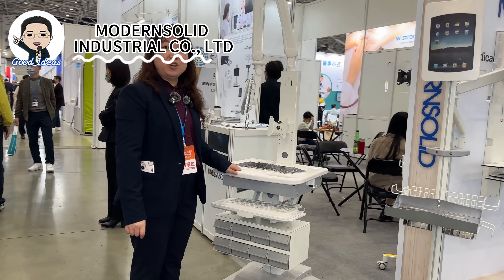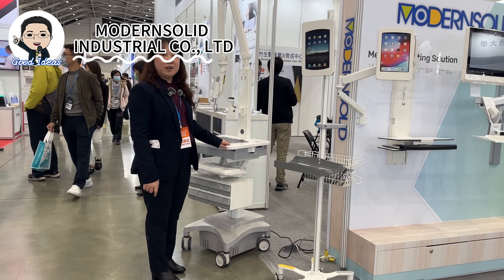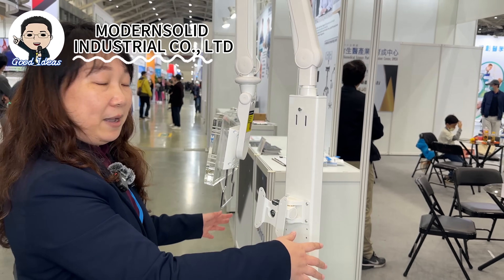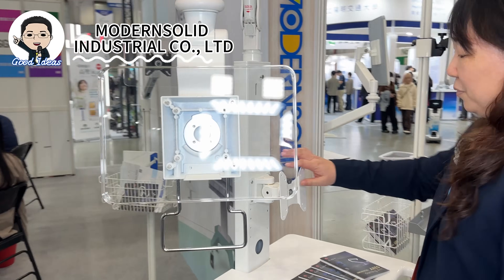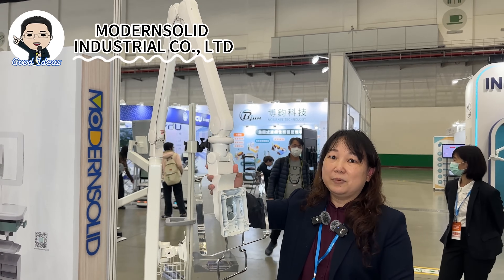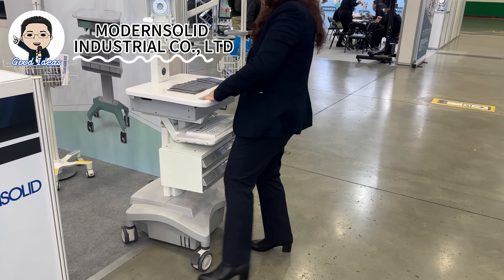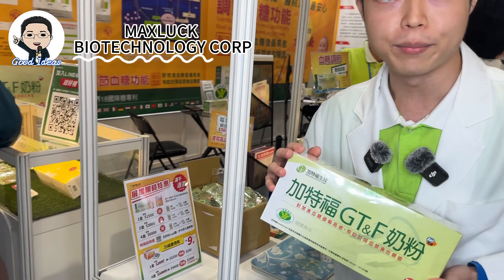Today we'd like to show our medical carts and site equipment for hospitals. We have options for one monitor, two monitors, or a laptop. We also have customized options for different terminals — you can put a monitor here, and we can add a customized monitor arm for a different kind of device. We have a very good medical-grade wire that is very stable.